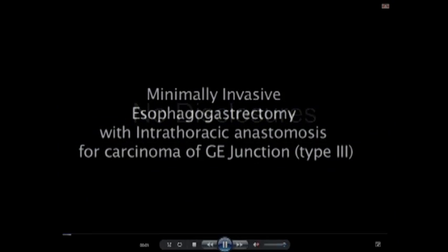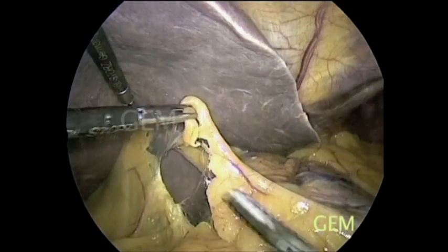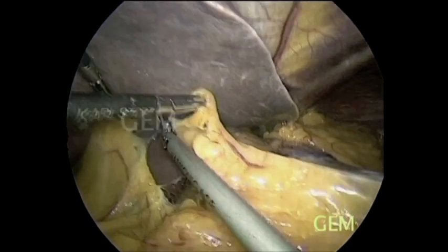This patient has adenocarcinoma of the cardia involving part of the stomach and lower esophagus. Therefore, esophageal gastrectomy is required. You can appreciate the growth, and the lesser omentum is being opened.